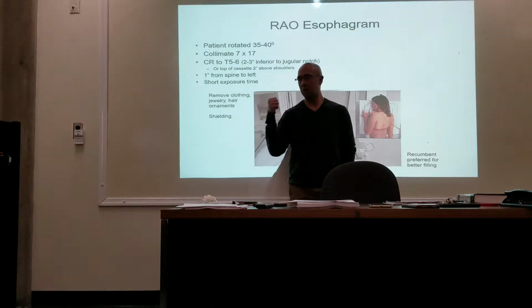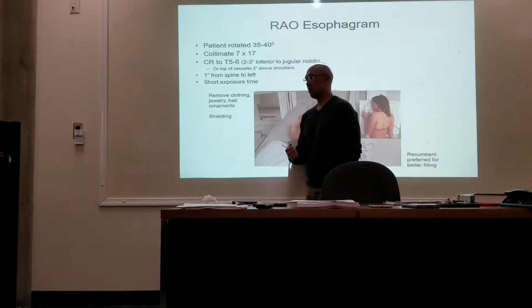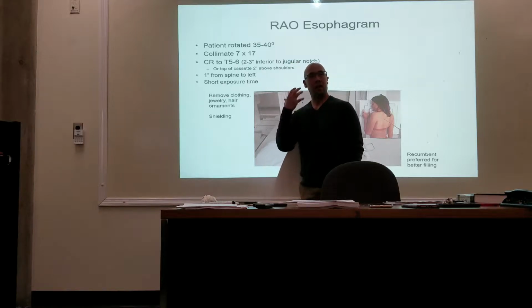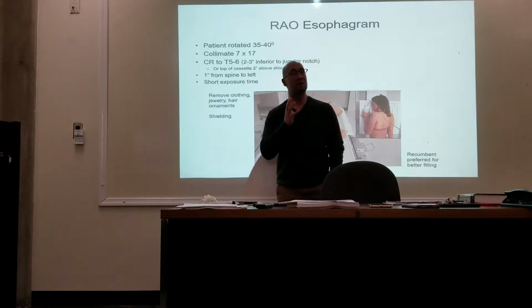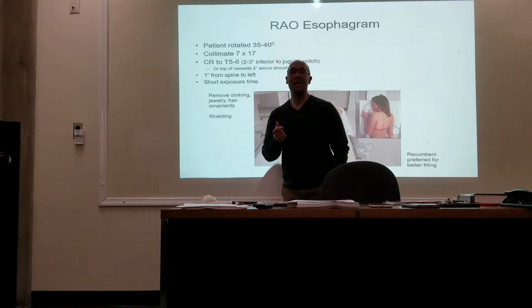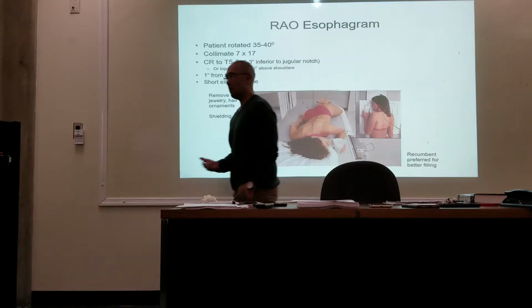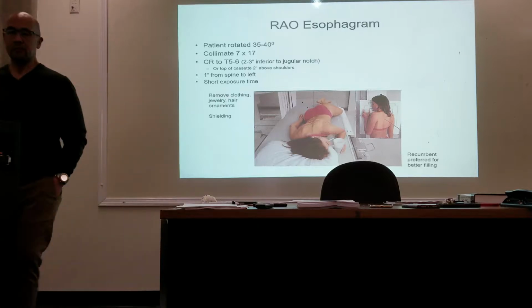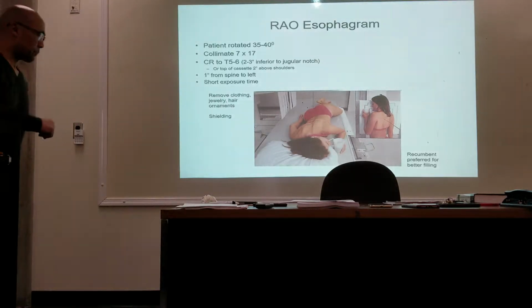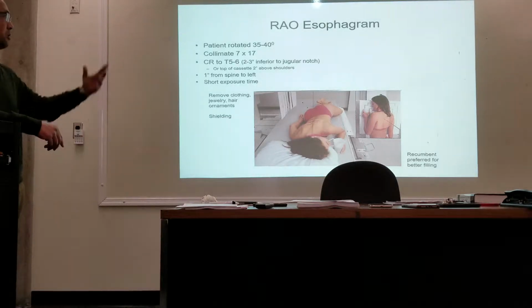Patient generally holds the cup in their right hand. Okay? They'll drink. Doctor observes. They'll go in a different position. Drink. Doctor observes. And he'll snap his photos or pictures. We call them spot films. Have you guys heard those terms before? Okay? The doctor will take his or her spot films accordingly. Upright, different positions. And then doctor leaves the room, and then you start your overheads.